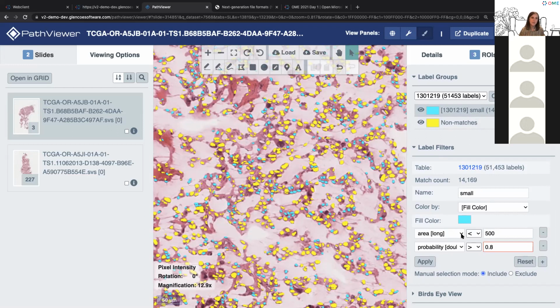You can build these kinds of manual classifications to play around with what the cell types are that I have represented here. But importantly, if you've already generated that data, let's say you have a column that specifies your classification, then you can simply use that column alone to build a visualization. So I'll show you that as well.